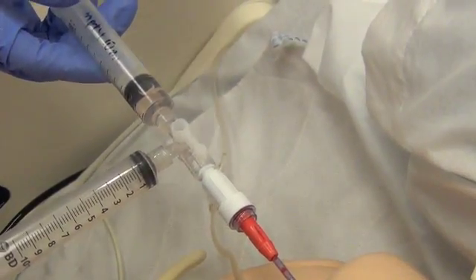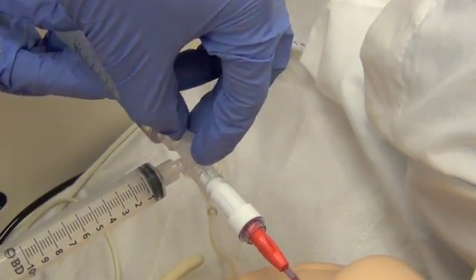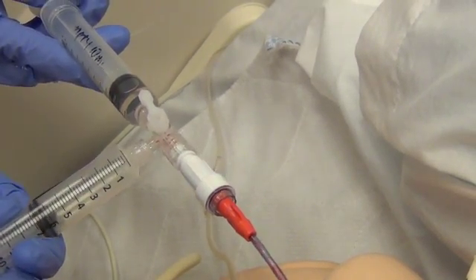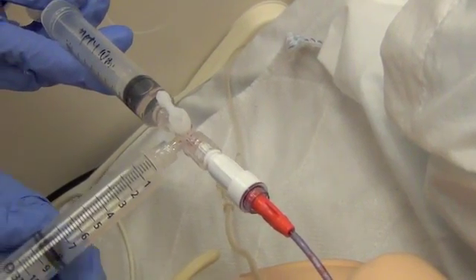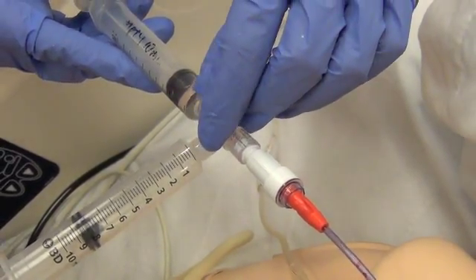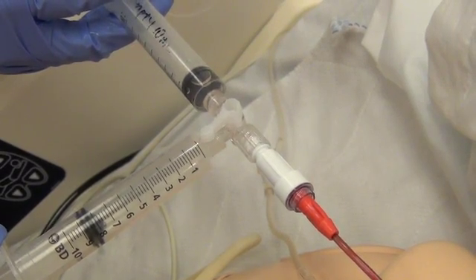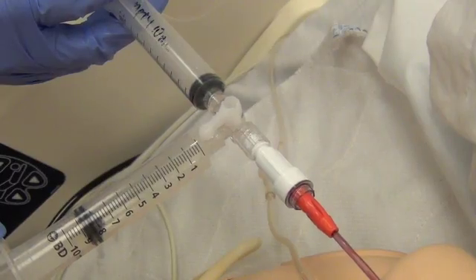Turning the stopcock off to the syringe with the Cathflo Activase, use the empty syringe to aspirate and hold back to the 8 milliliter mark. Turn the stopcock off to the aspirated syringe; the 2 milliliters of Cathflo Activase will automatically be pulled into the catheter. Turn the stopcock off facing the catheter.